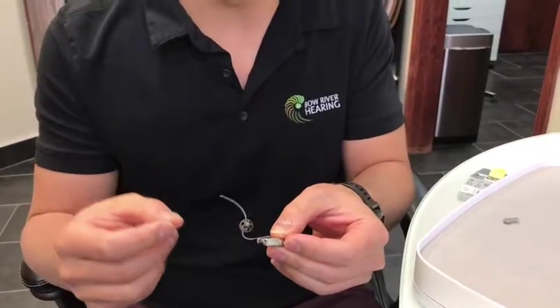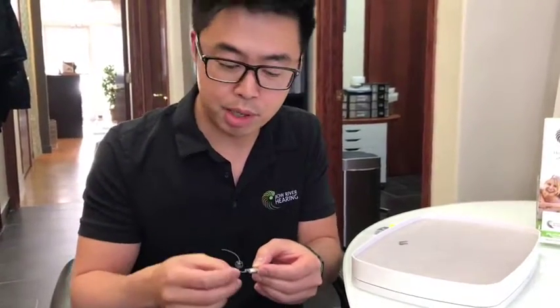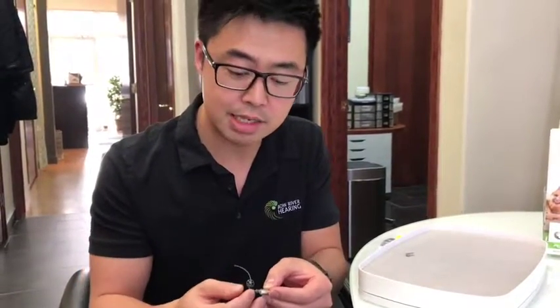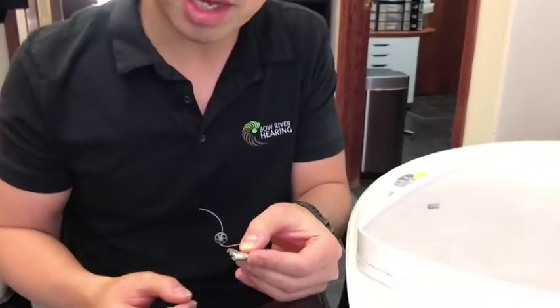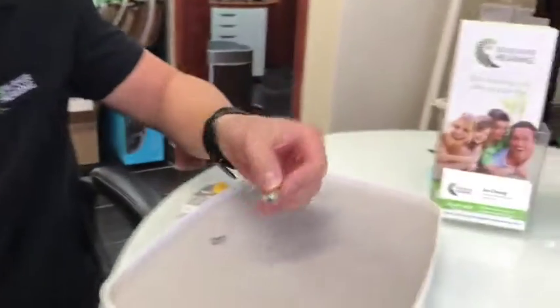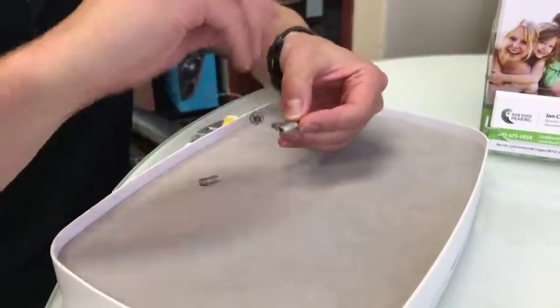A lot of times what we find is our patients might try to get the battery out with the door not completely opened, and sometimes you might end up breaking the door. So we always advise that you pull the door all the way back until it can't go any further. From there, you can just flip it over and it'll come out, or what we recommend is to grab one of these magnets. If you don't have the magnets, you can just drop by any of our four locations and ask them to give you one of these sets.